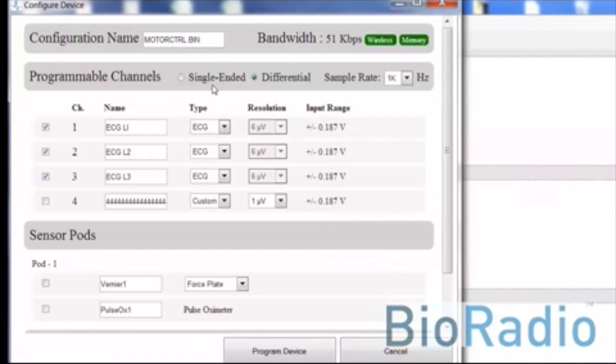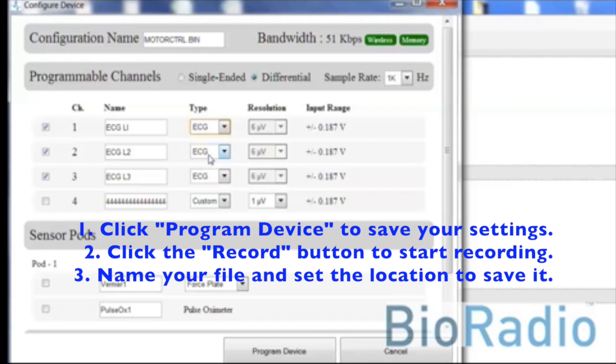In the device configuration screen, you can customize channel settings, set up sensor pods, and set your sampling rate.